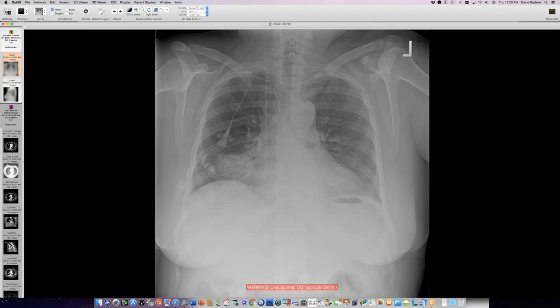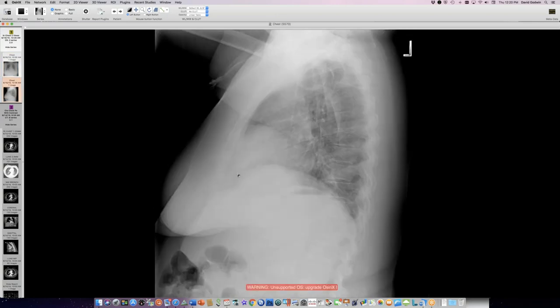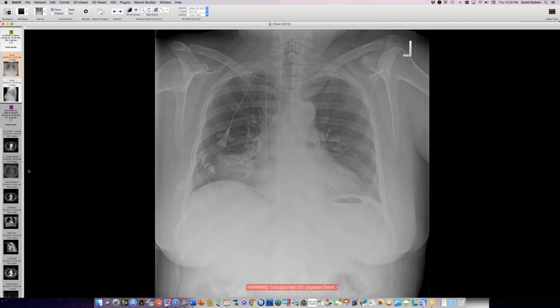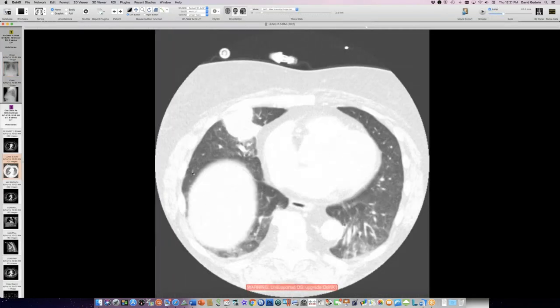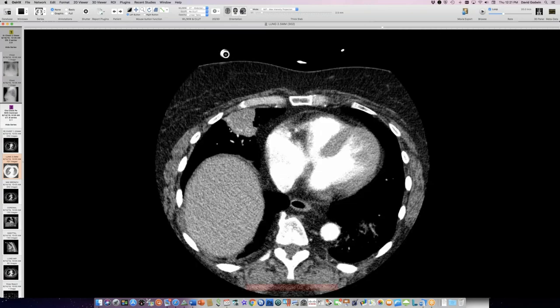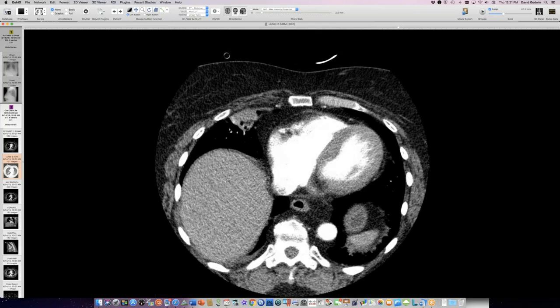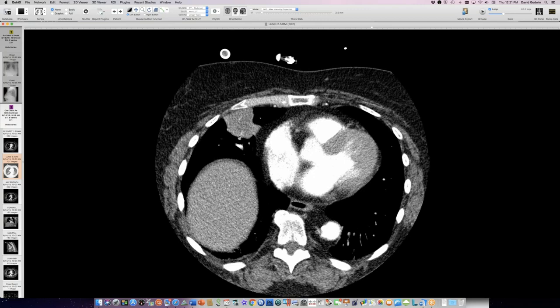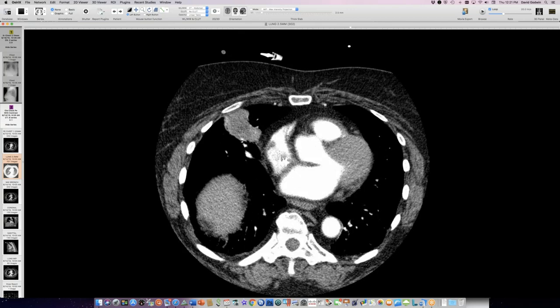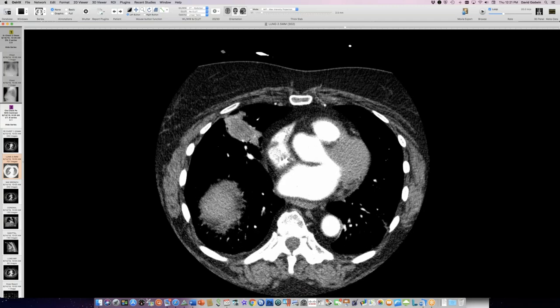Here's a woman who has had a stem cell transplant. Her neutrophil count has recovered after her transplant. She developed this basal lesion — actually a middle lobe lesion. People were worried about infection, and here it is as a nodular infection in the middle lobe. Very dense. We were talking last week — one of the things with fungal infections is you don't get air bronchograms very often. This one fits that pattern of not having good air bronchograms, and there's a hint of some central lucency or necrosis.